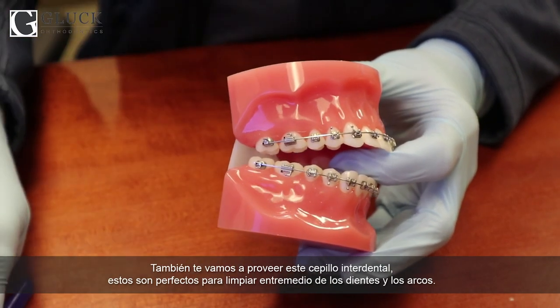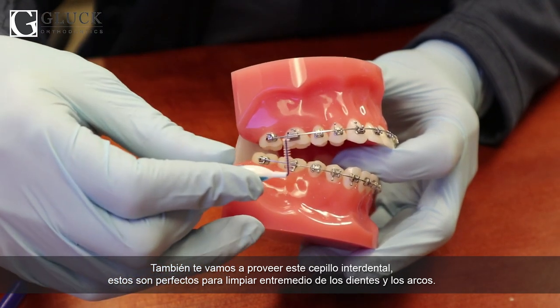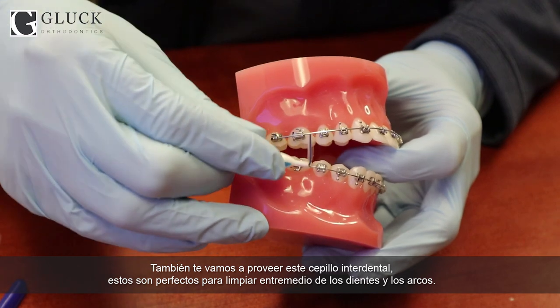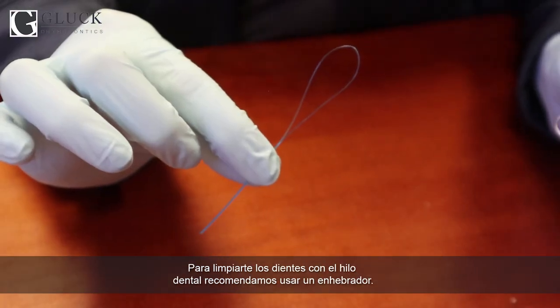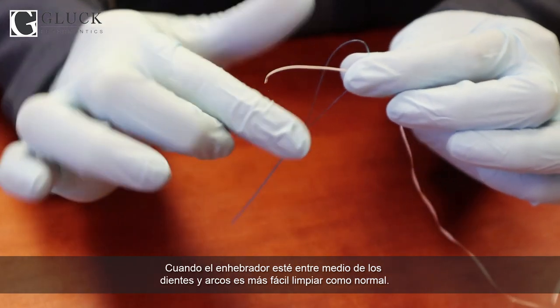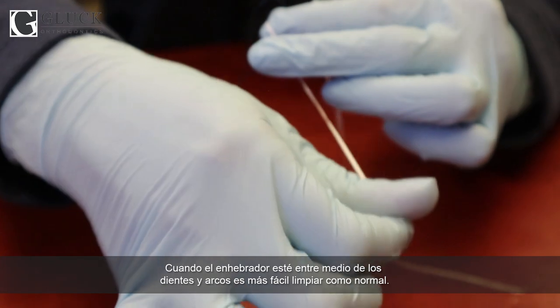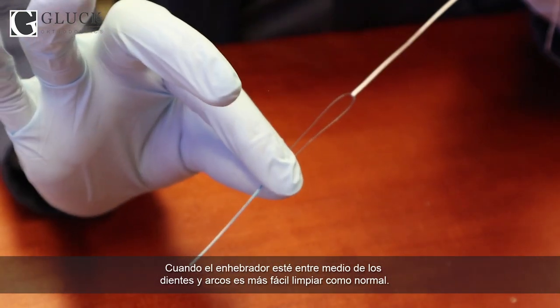We will also provide you with a proxy brush, which we also call Christmas tree brushes. These are great for cleaning under the wire and in between the teeth. When it comes to flossing, we recommend using a floss threader. These are helpful by threading the floss between the teeth. Once the threader is between the teeth and underneath the wire, it's easy to pull through and floss like normal.